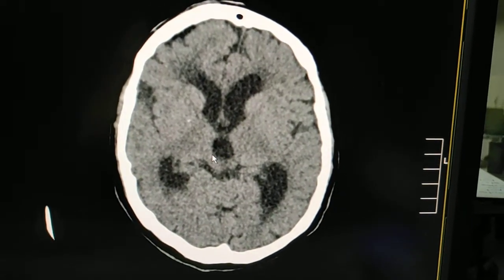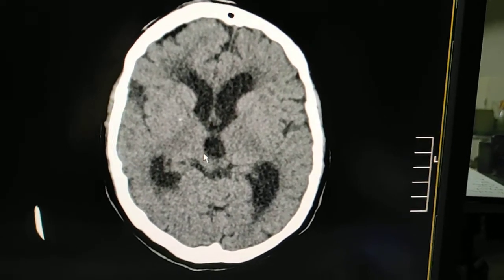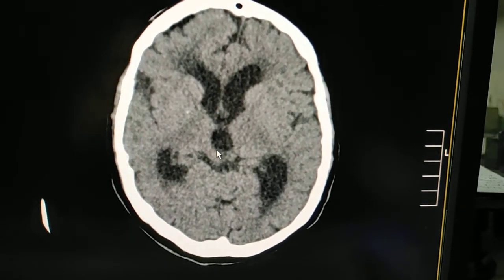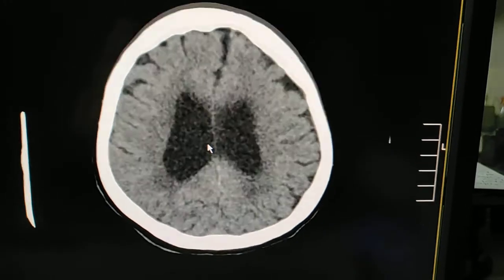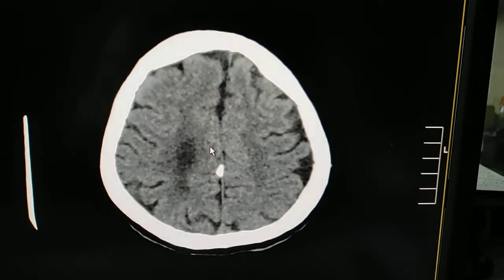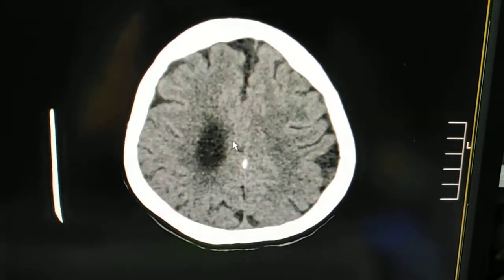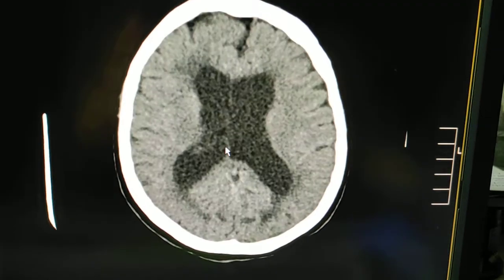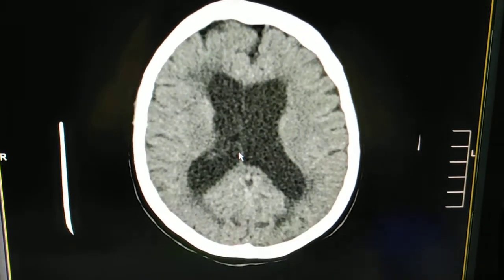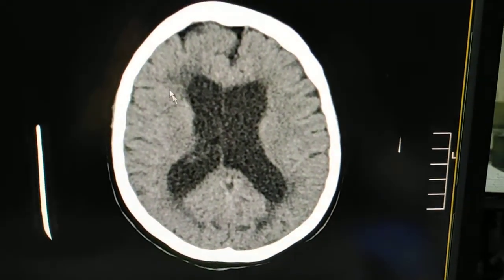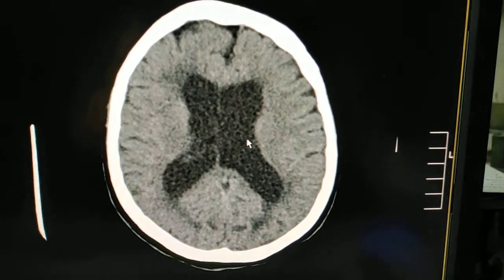The third ventricle is also dilated, and both the lateral ventricles are dilated as well. This could be NPH. Periventricular ooze is also noticed.